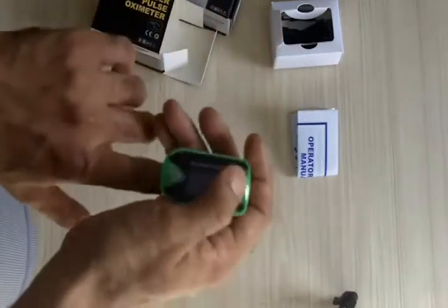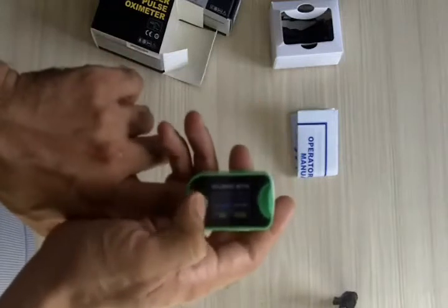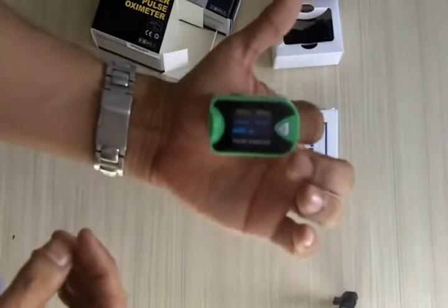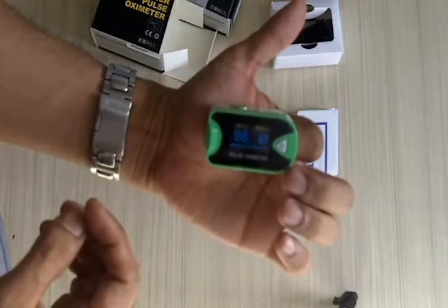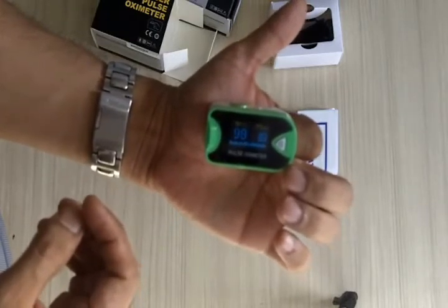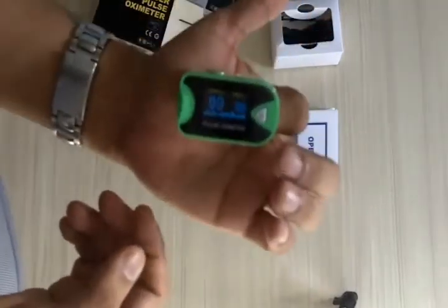To use it, you have to press your finger inside completely, right to the end, and then you can press the button and you're good to go. Within a few seconds it will start giving you the pulse rate as well as the SpO2 levels.